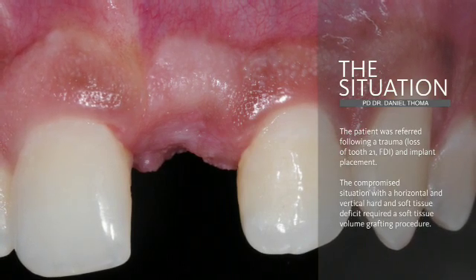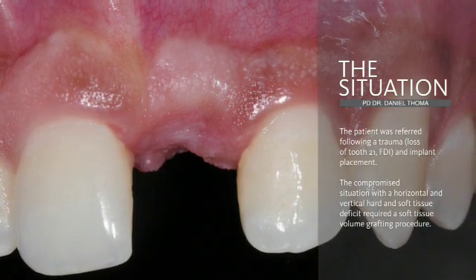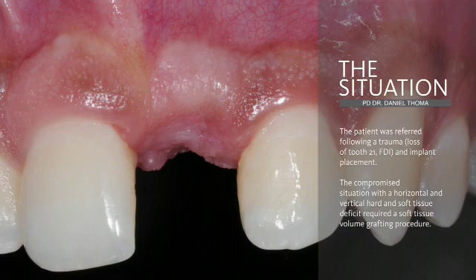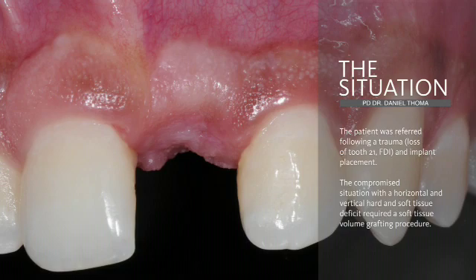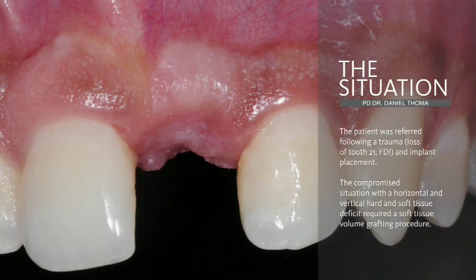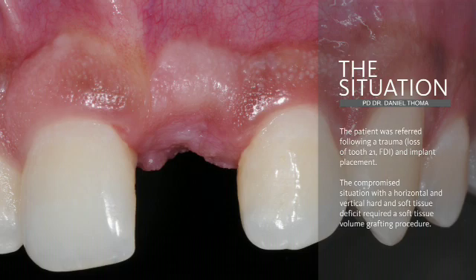The present clinical situation describes a young patient who was referred to the clinic with a missing central incisor 21 and an implant being placed in the respective site. The patient is an Afro-American male who does not smoke and drinks occasionally. Following a trauma on 21, an implant was placed and the patient was referred for an implant-borne reconstruction.